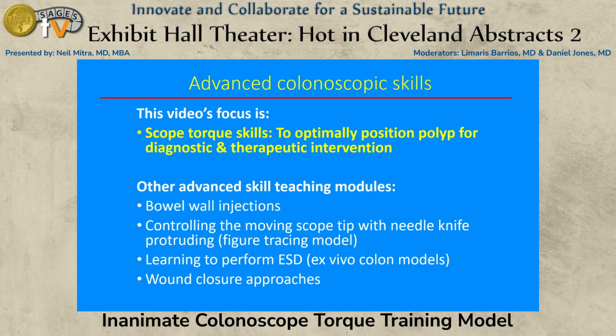The focus of this presentation is scope torque skills, which are needed to position and orient the scope so that it is possible to interact with polyps or other pathology that is encountered in the colon. There are additional teaching models in the Northwell program that cover other advanced skills listed on this slide.